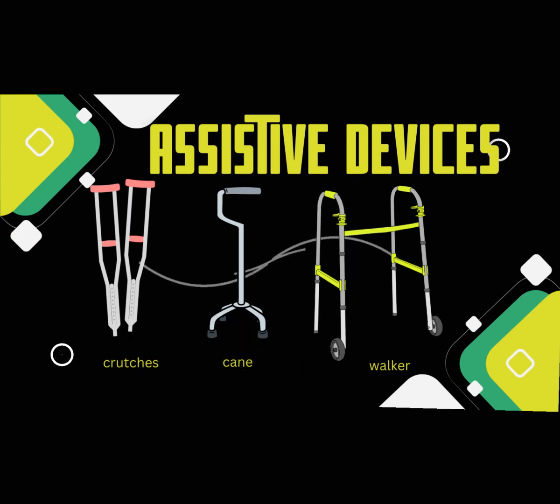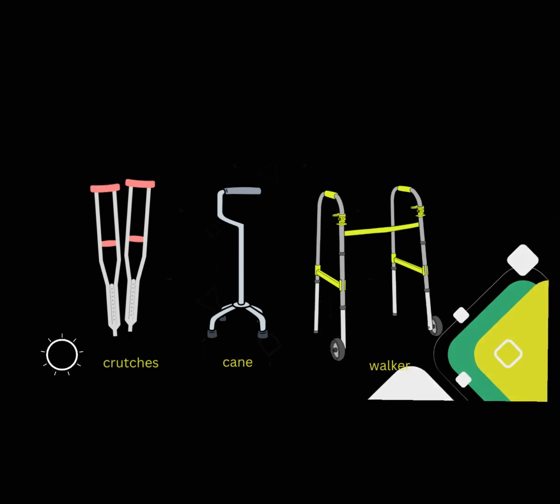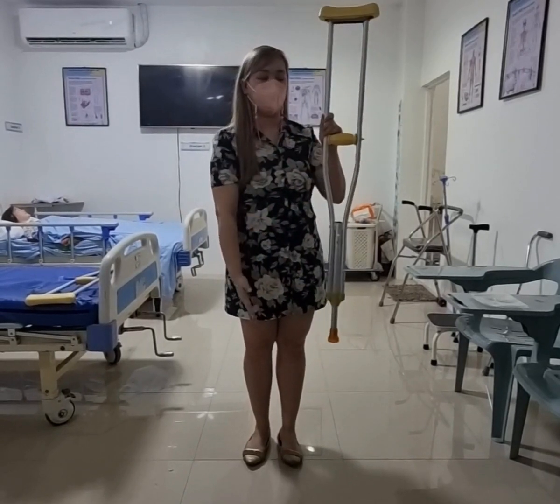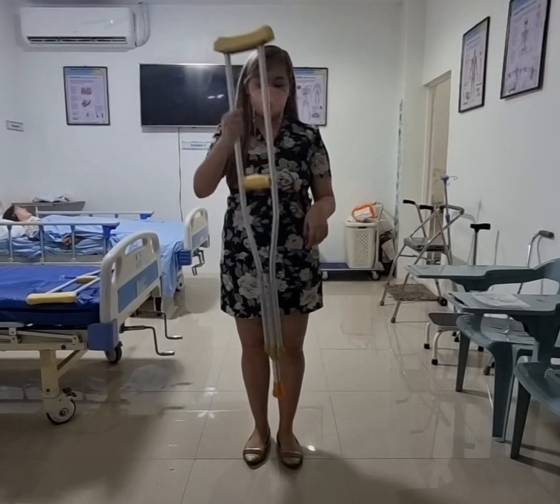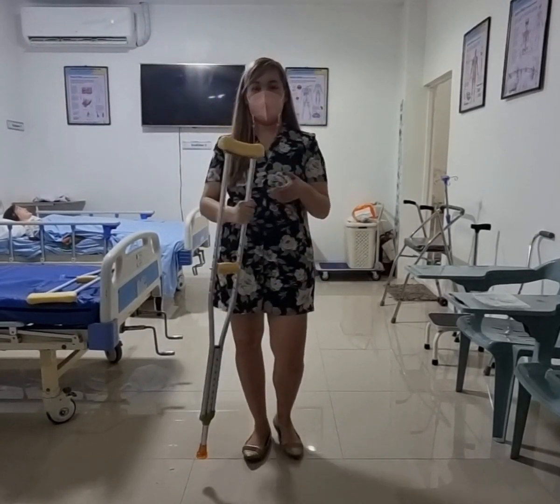So for today's video, ang topic po natin is assistive devices. So this includes crutches, cane, and walker. So unahin natin yung crutch. Ito po yung crutch or saklay. This one is the crutch pad, hand grip, length adjustment area, and then yung ferrule or rubber tip.